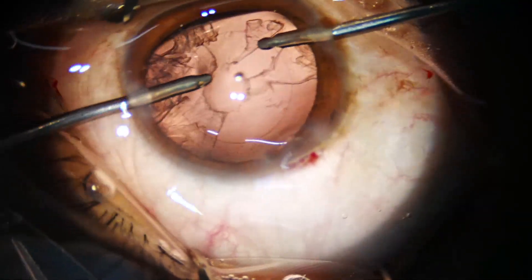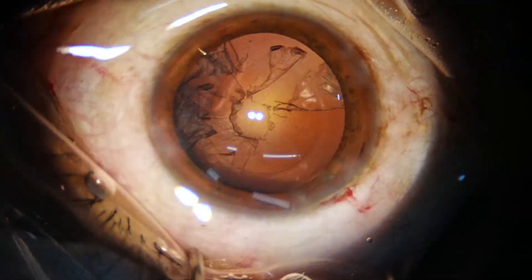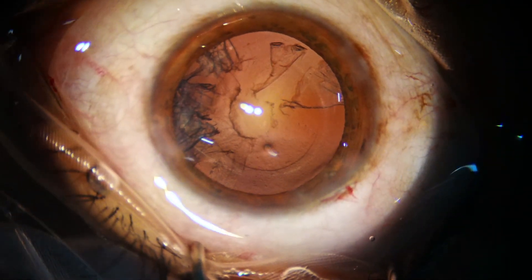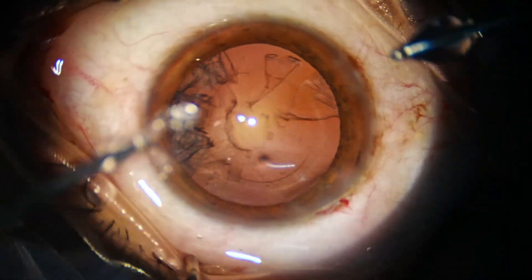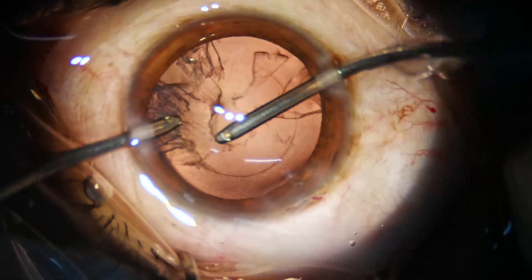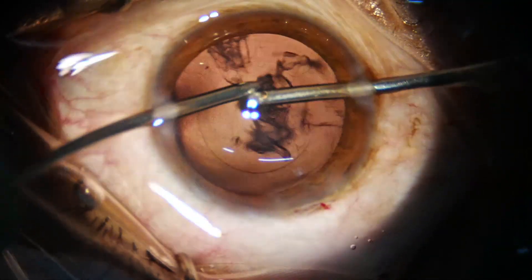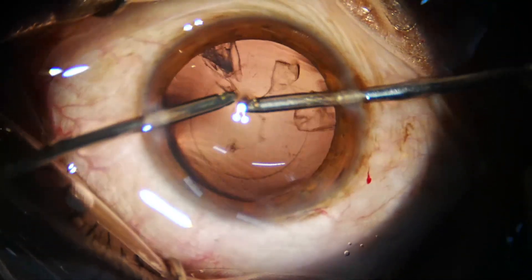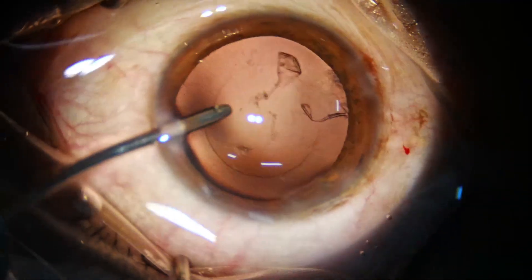We must hold the anterior part of the cortex — do not try to hold the part which is resting on the posterior capsule. Now we will take the irrigation in the left hand and aspiration in the right, and aspirate the cortex on the left side. Most of the cortex is removed by this time. This is a real-time video clip.